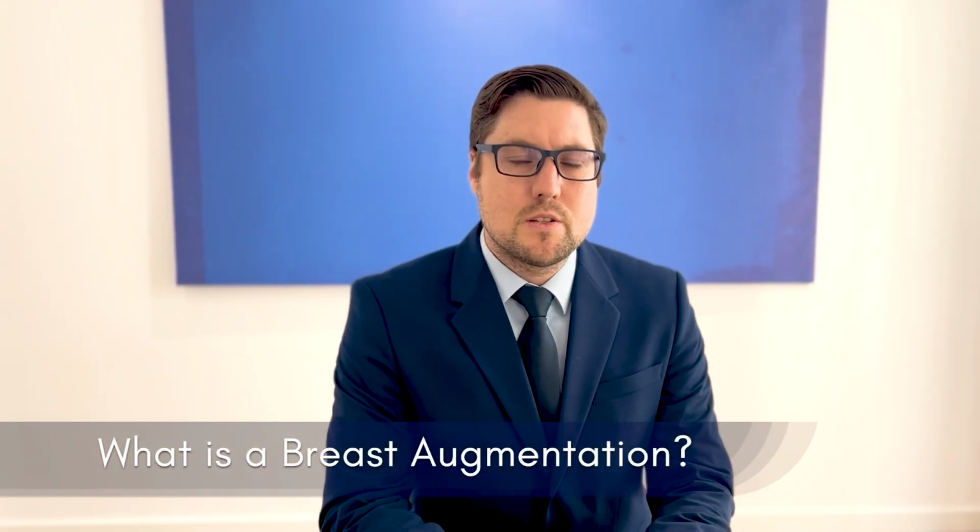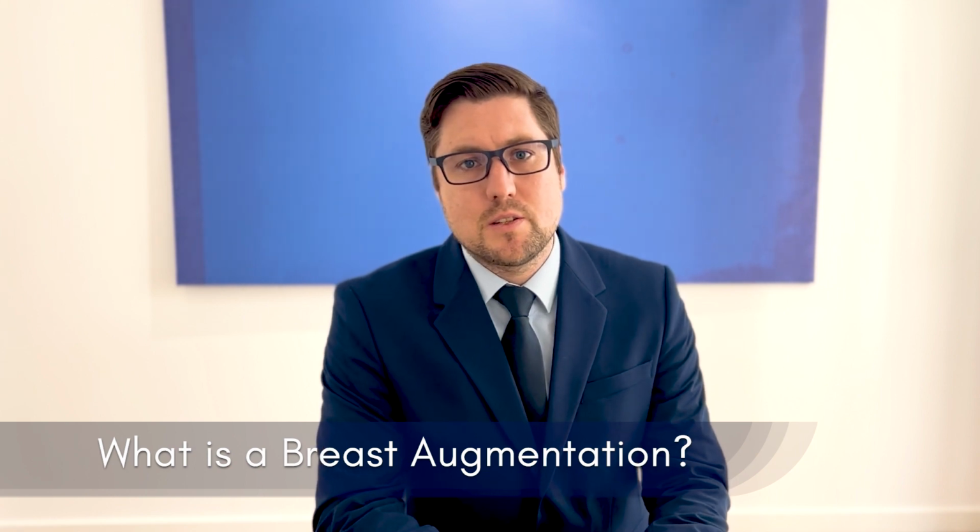Breast augmentation is a commonly performed plastic surgical procedure, and it is used to add volume to the breast. Implants these days are well made, and the ones that we most commonly use are made of silicone. They're composed of an outer shell, which can be smooth or have texturing, meaning it is slightly rough to the touch, and inside the implant there is a more viscous silicone gel.